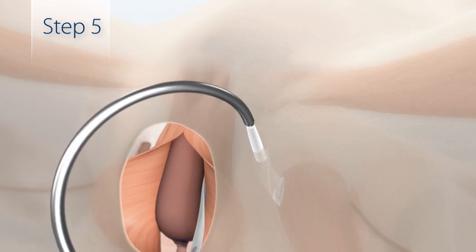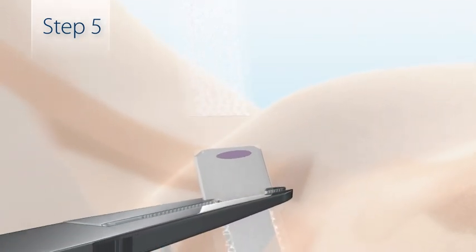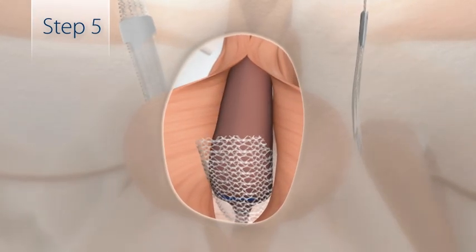Pull only enough to bring the center of the sling to the patient's midline. Cut the sheath and mesh above the blue dot on the end portion of the plastic sheath. The needle passage and sling connection are now repeated on the patient's contralateral side.